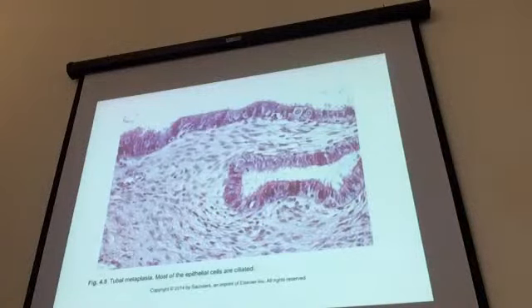If we find cilia, that helps us to say, oh, ciliated metaplasia. You can also get endometrial type epithelium mixed in with this at times. So it actually looks like endometrium and tube. That's usually in the higher endocervix where that occurs.